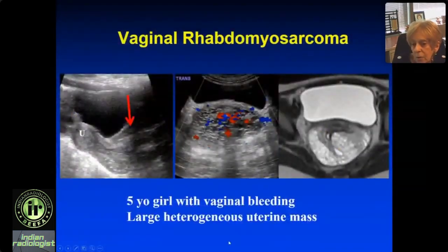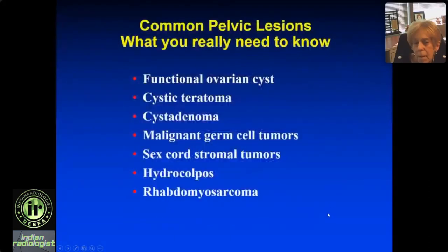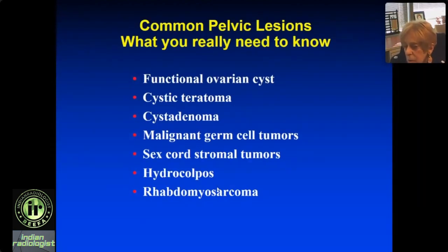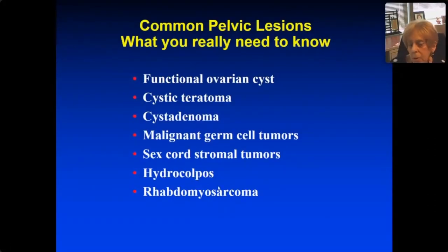A 5-year-old girl with vaginal bleeding: here's the uterus, probably with blood product in it, and the vagina is very vascular. The MR shows a large heterogeneous mass — that's rhabdomyosarcoma. To summarize common pelvic lesions: functional ovarian cysts are really common. Cystic tumors are teratoma and cystadenoma. Malignant tumors are solid — usually germ cell tumors in adolescents, and sex cord stromal tumors in prepubertal girls. In the vagina and cervix, the benign lesion is hydrocolpos and if it's malignant it's rhabdomyosarcoma.